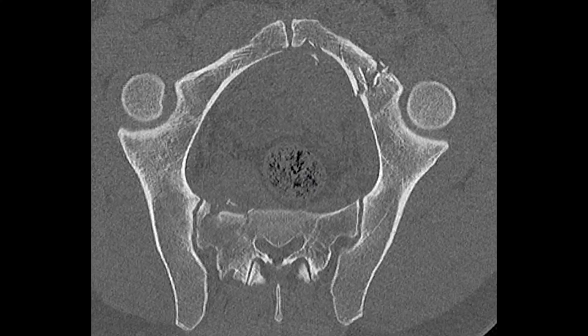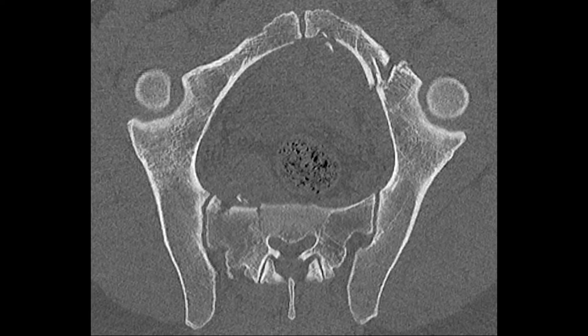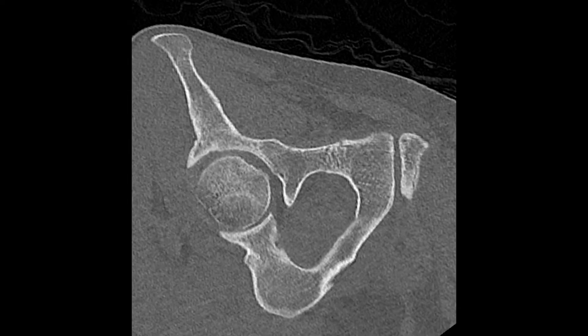Hello, dear friends! Today we are going to analyze the osteosynthesis of a complex pelvic injury consisting of bilateral pubic bone fractures and sacrum lateral mass fracture.